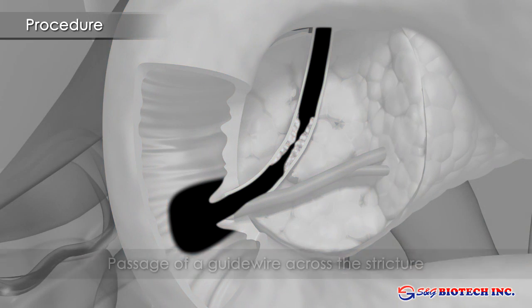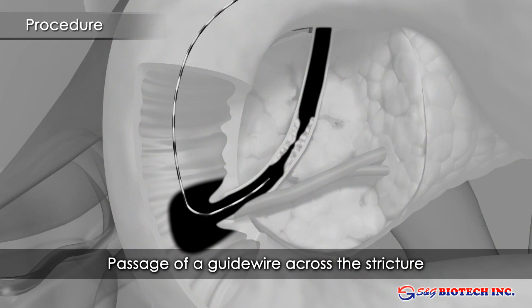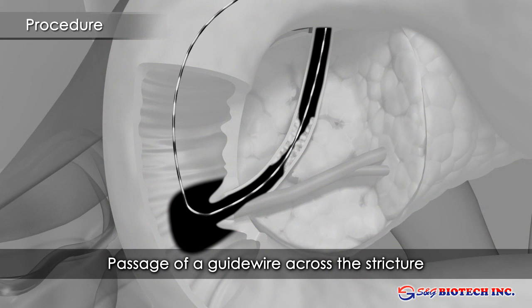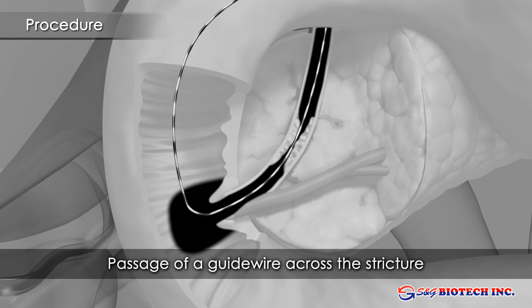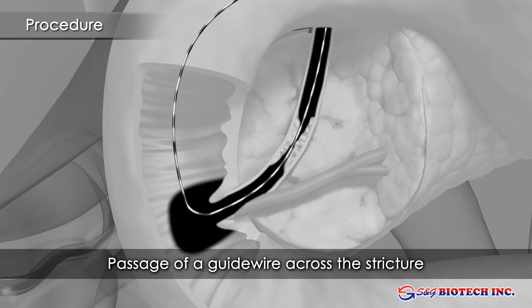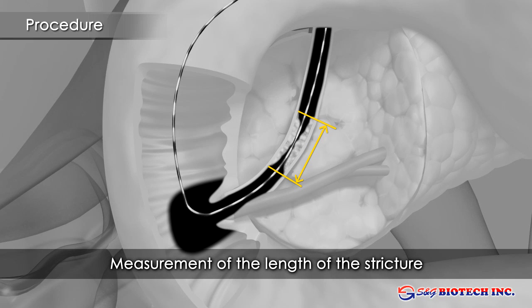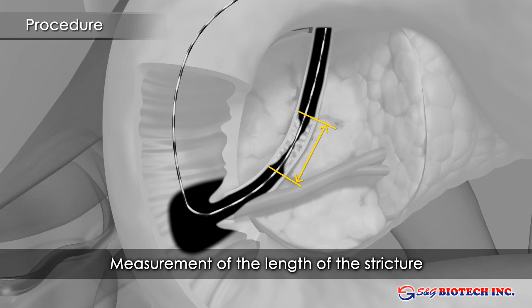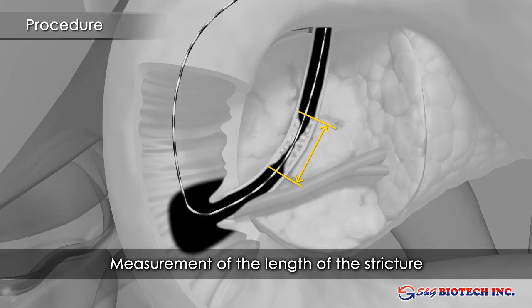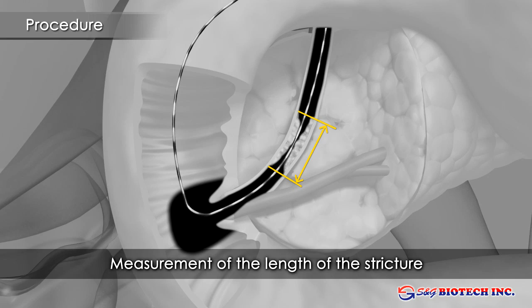The stricture is crossed with the help of a hydrophilic guide. The wire may be used to gauge the length of the stricture. Depending on the type of the cannulation wire, it may need to be exchanged for a stiffer wire to allow stent insertion.